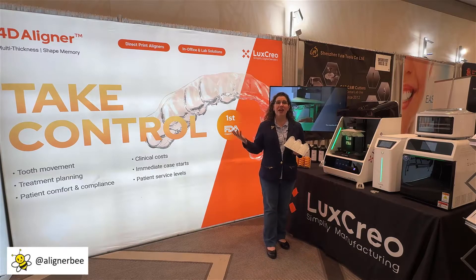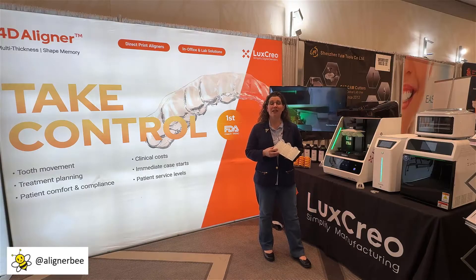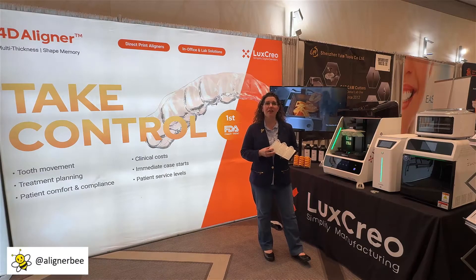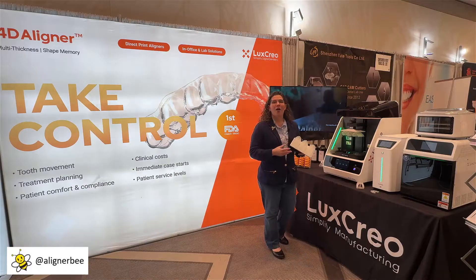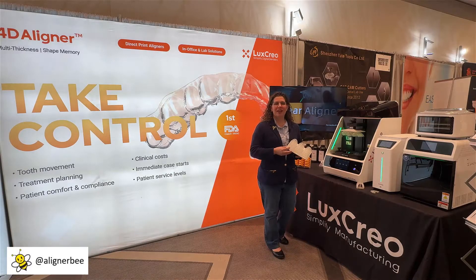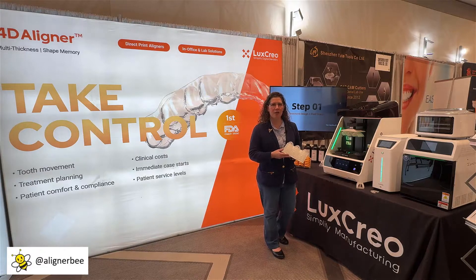I'm here today at the Lux Creo booth. Lux Creo is one of the few companies that has FDA 510 clearance for their direct print aligner product, so I wanted to take a look and see how their system is set up. What we see with direct printing aligners and what tends to have a lot of attention is how we post-process, and Lux Creo has the iLux system that I wanted to take the opportunity and review today.